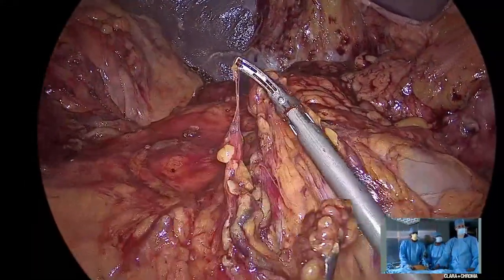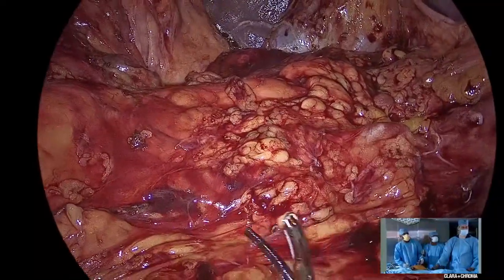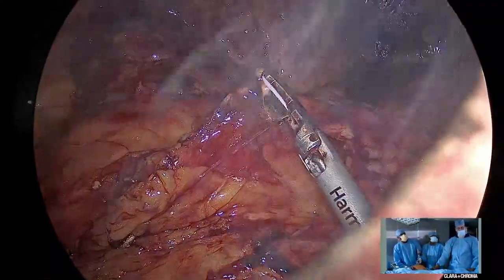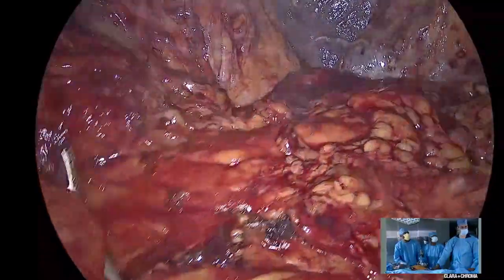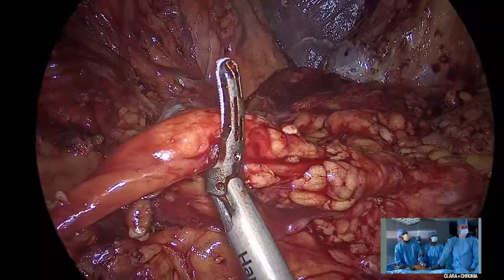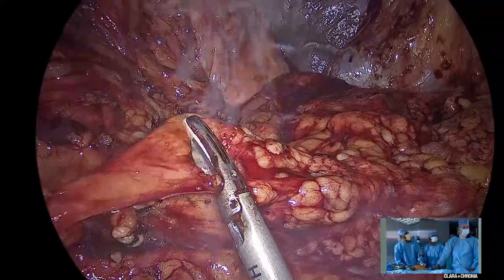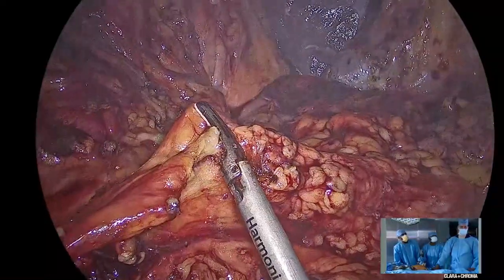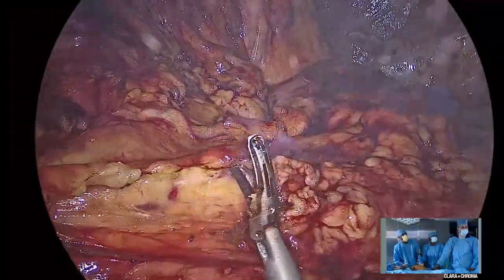We will do all of this in this position, and when we get to the middle colic, we'll see if we can carry on in this position itself, or if I have to come to the foot end. So just going layer by layer, nothing else. Let's see. Sometimes you are lucky and you can get into it.